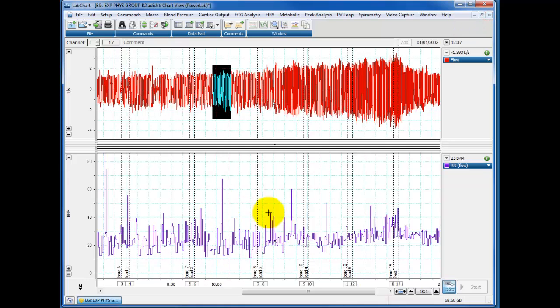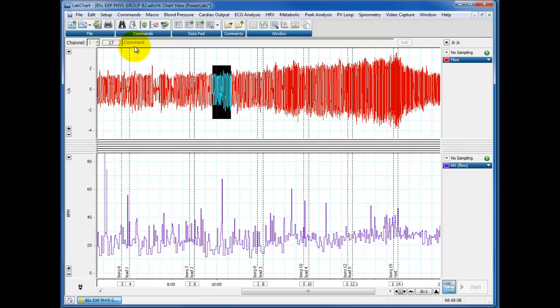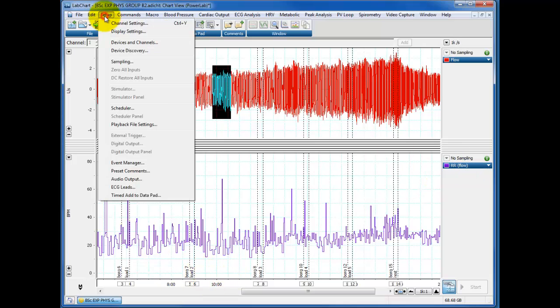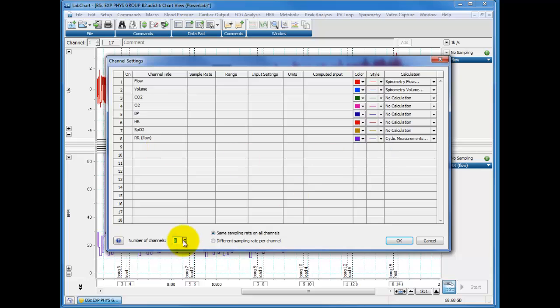We may want to smooth these data somehow, we may want to bin them, in other words cut them into segments. So I'm going to add another channel at this point, so nine channels. I'm going to call this RR flow smooth and I'm going to use a smoothing algorithm.